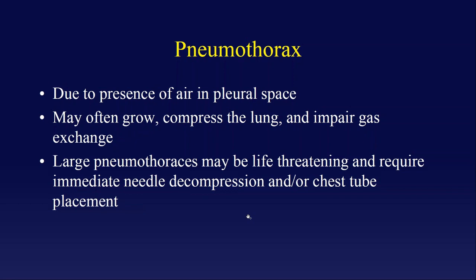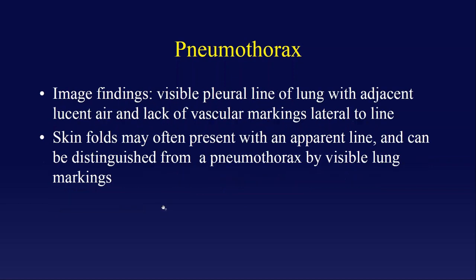So, one, why is the pneumothorax there? If someone just had chest surgery, that's expected, okay? And two, is it going to grow? That's the real problem, the growing pneumothorax, okay? So like I said, if someone just had chest surgery, you kind of expect it to be there. You just check to make sure it doesn't get bigger. If you have someone come in off the street with shortness of breath and pneumothorax, that's a problem, okay? There's not a good reason for it to be there, and you basically have to assume it's going to get larger, and get a radiograph to demonstrate that it's not, okay? And a large pneumothorax can be life-threatening and require immediate needle decompression and/or chest tube placement.